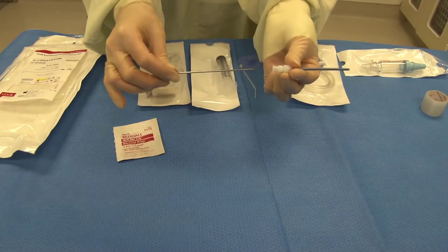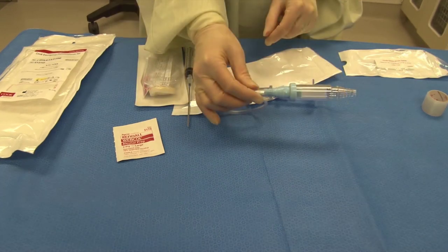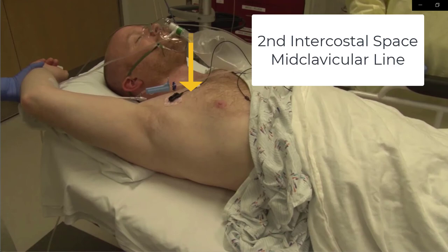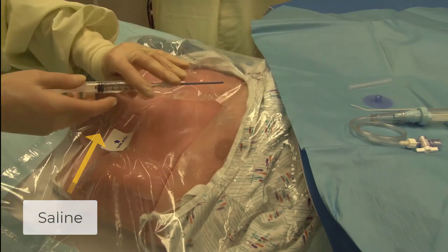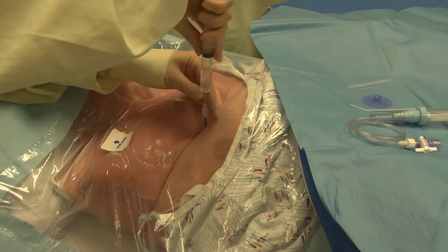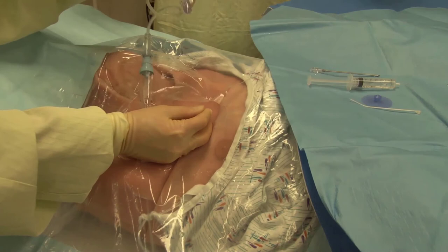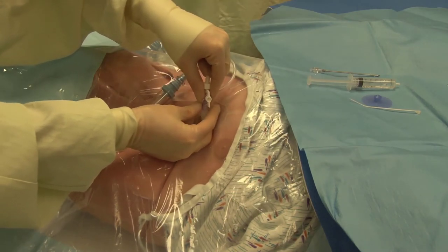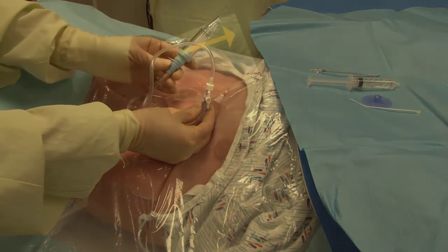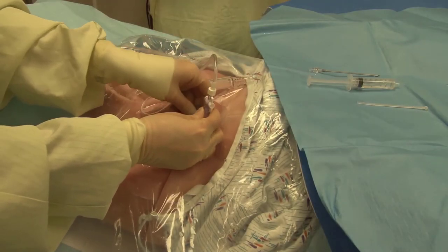A dedicated emergent pneumothorax kit has a longer, armored catheter that is less likely to kink and a true flutter valve to allow air out of the chest but not in. Insert the catheter and needle into the chest until a rush of air is heard. Or, if you have a moment to put a few cc's of saline into a syringe, pull back on the plunger as you advance the needle until bubbles freely flow into the syringe. This indicates you've reached the free air in the pleural space. Then advance the needle and catheter together at least a few extra millimeters to ensure the catheter itself enters the pleural space before advancing the catheter until it is hubbed and withdrawing the needle. Attach the flutter valve via the included flexible tube, making sure the valve is oriented the correct way and the stopcock is open to let air escape. The catheter can be secured with a soft flange or taped in place.